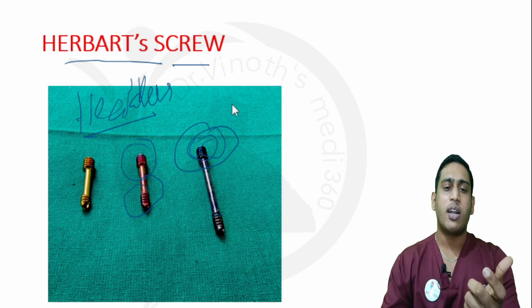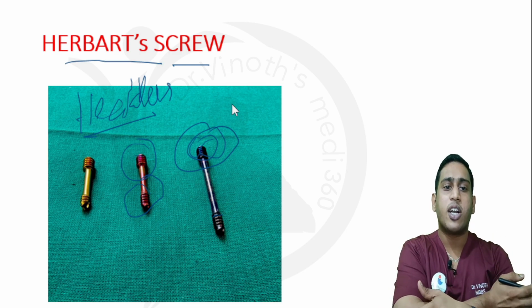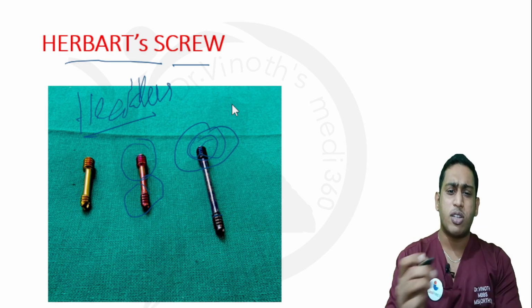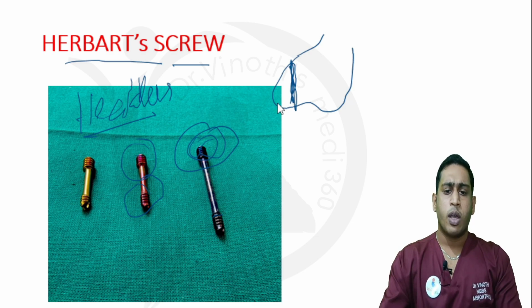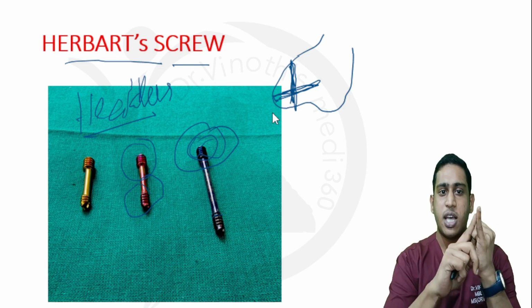Whenever there is an intra-articular fracture, assume that the patient has a lateral condyle fracture of the humerus, or a lateral epicondyle fracture of the humerus. I cannot fix a plate because the chunk will be very small. This is the lateral condyle, and only this part is fractured. So I need to put something to fix this fragment. That is the first purpose.